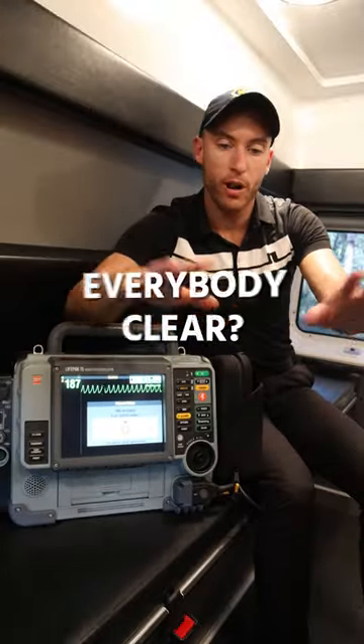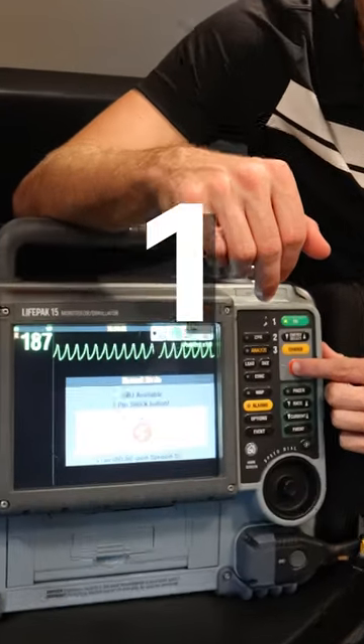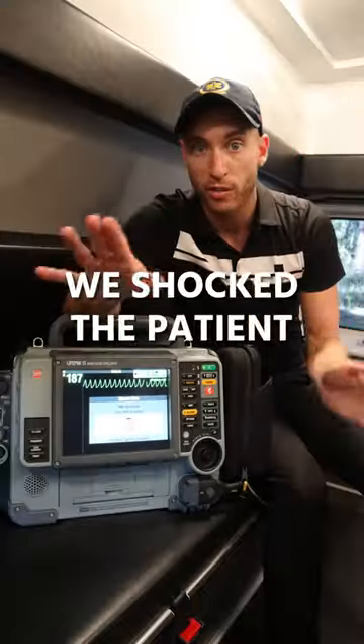Everybody clear. I'm clear. 3, 2, 1 — and shocking. And now we shock the patient.